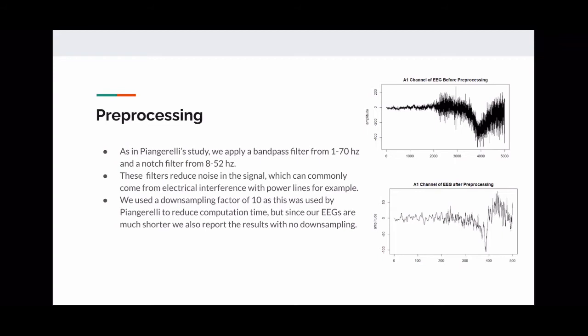Before analyzing the data, we have to do a step called preprocessing. If you're an EEG technologist like myself, I'm sure you're familiar with all different types of artifact and know all about the filters on your EEG equipment. A filter that we use all the time is called the notch filter, or the 60 Hertz filter, to filter out electrical interference from all different stuff that could be plugged in in the ICU, or even just the bed being plugged in itself can help create 60 Hertz artifact, which distorts the EEG signal, and it's hard for the doctor to see what's going on.